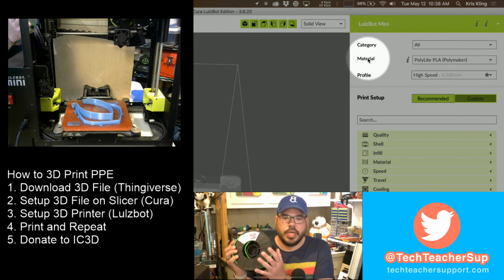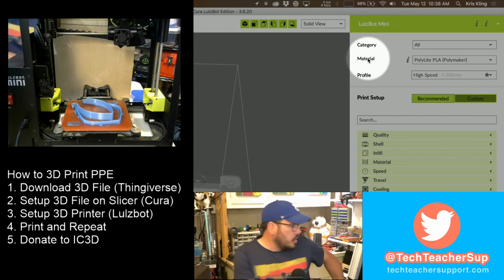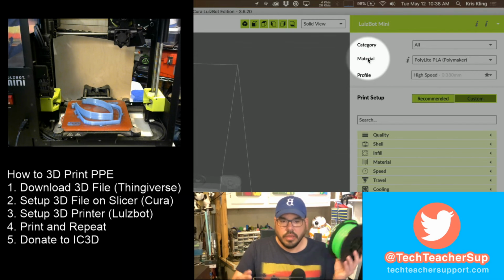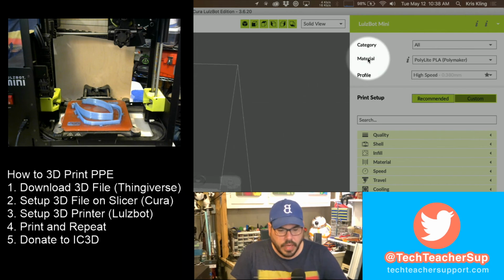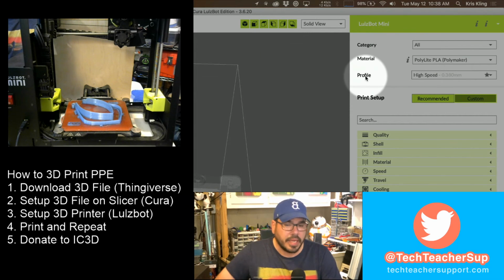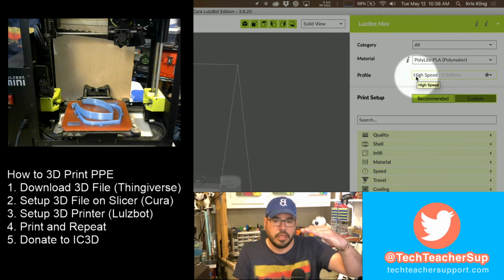This is IC3D. They also make an ABS filament, PETG. There's a lot of different filaments that are made, so you make sure you tell your computer which one is actually loaded into your machine. So in our machine right now, we have PLA, so I have set that as PLA. And then profile here is high speed. You have 3 choices: really high detail, regular, or high speed.